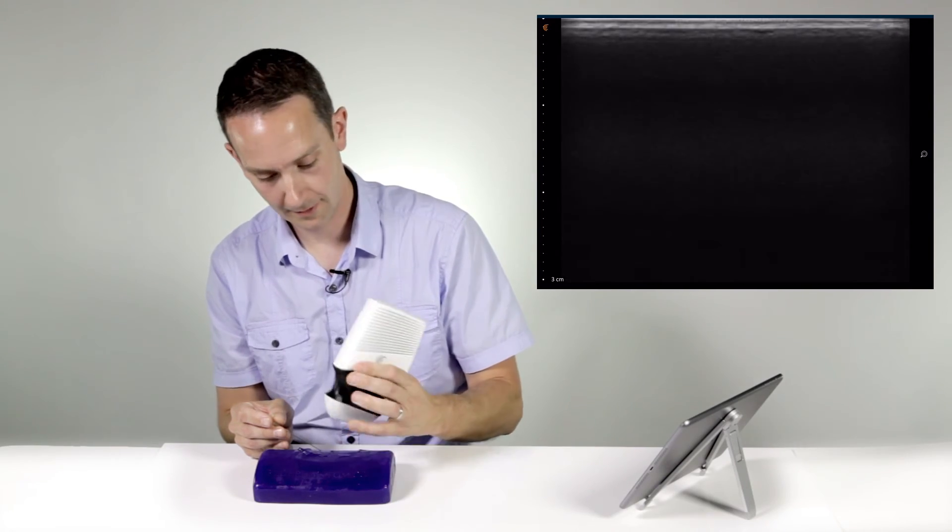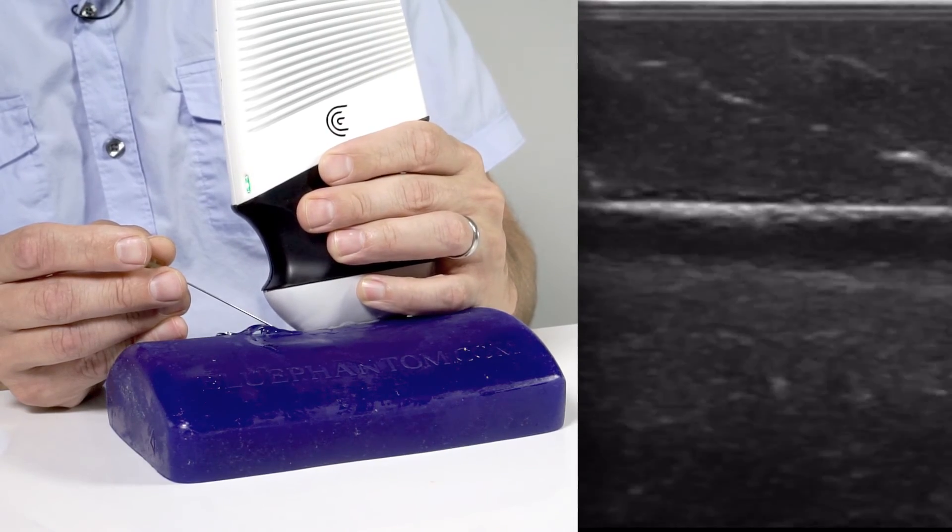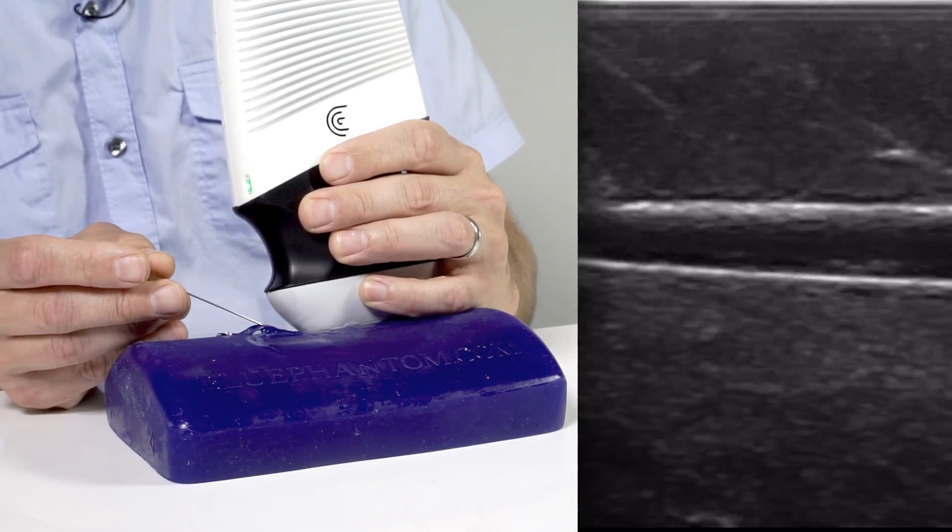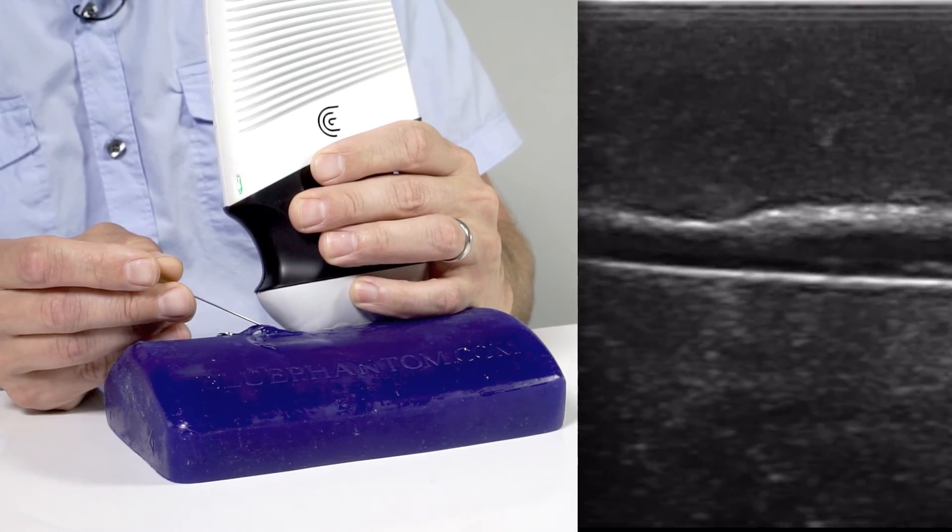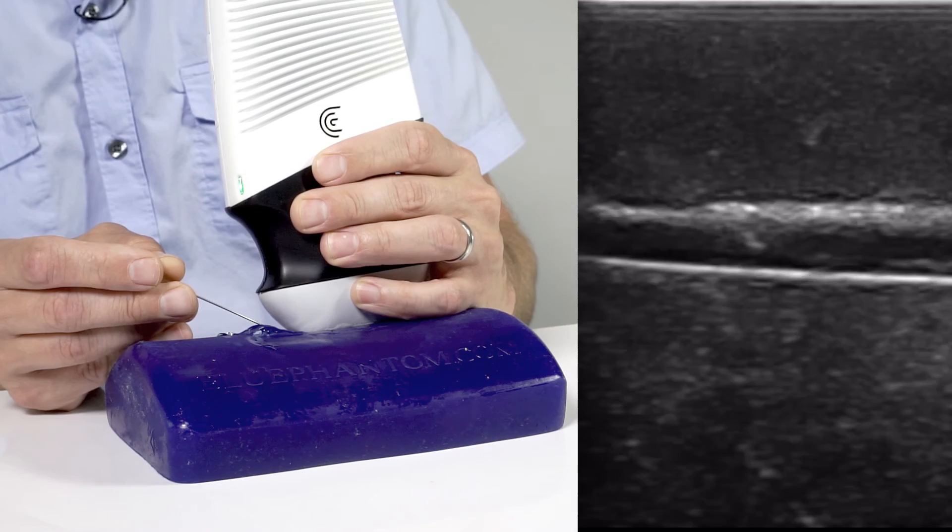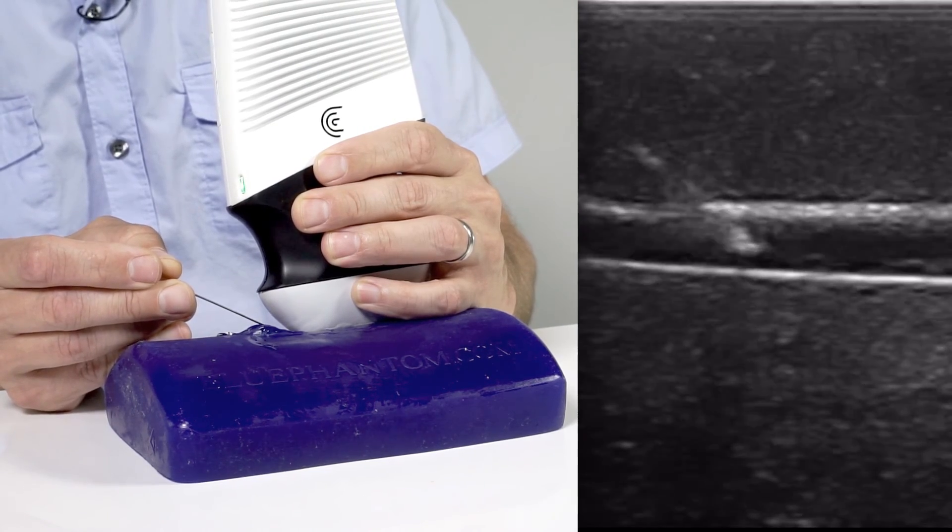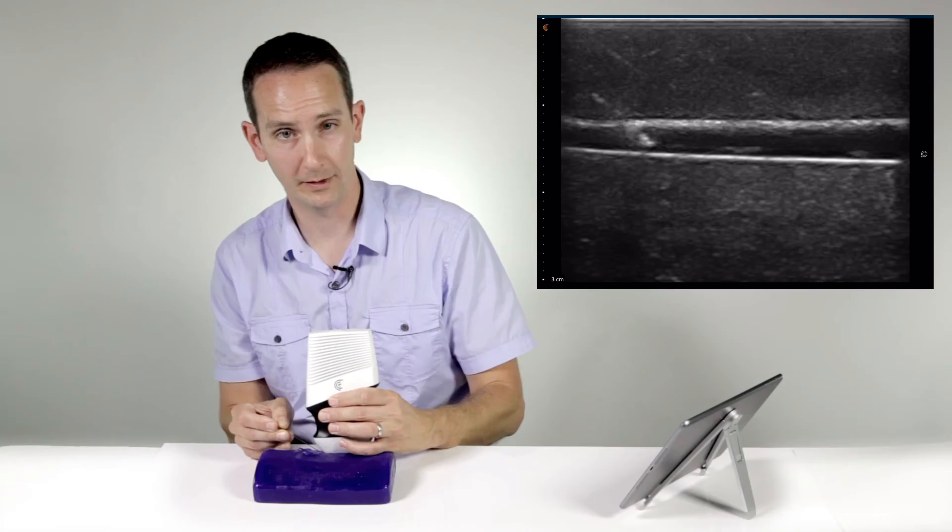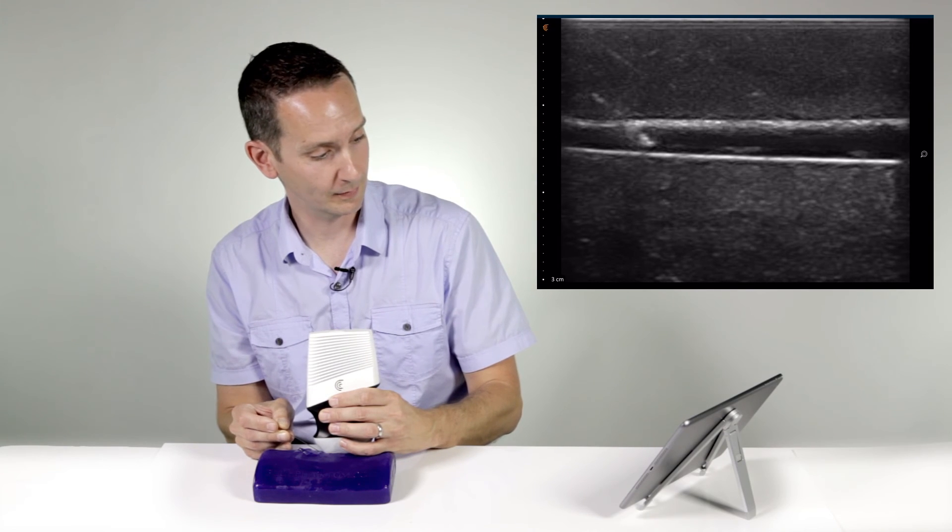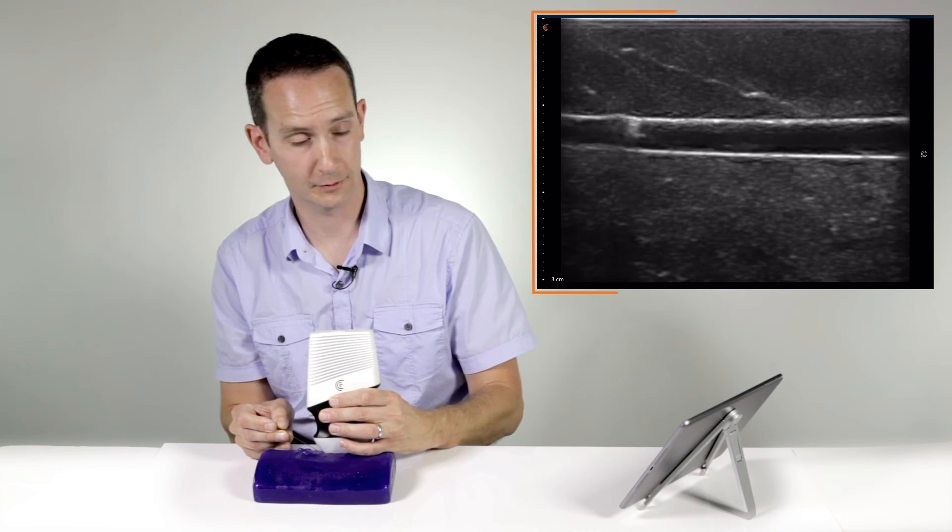Now I'm going to rotate into a long axis and I'm just going to advance the needle the last few millimeters until it enters the vessel. And this way you can ensure that in fact the needle tip is in the vessel and it's not gone beyond the plane of the ultrasound beam.